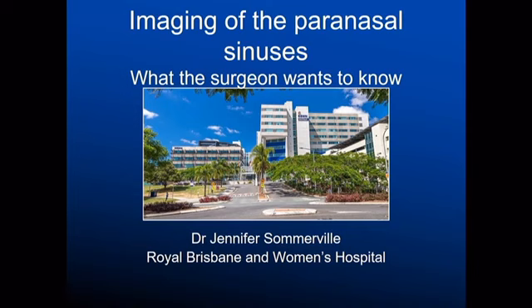I'm just going to give you a brief run through on imaging of the paranasal sinuses, mostly concentrating on what things are important for the surgeon to know.